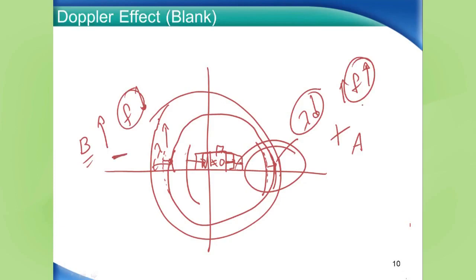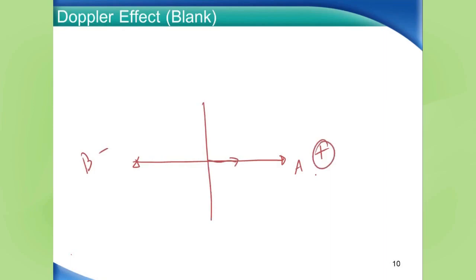So we now should understand what the Doppler effect is. It's an apparent change in frequency caused by a change in wavelength caused by motion relative to the observer. And what is so important about that term, relative to the observer? Well, this is going to refer to our angular aspect because notice, observer A saw the exact opposite effect as observer B. Because the train was moving towards observer A, we saw a positive. Because the train was moving away from observer B, we saw a negative.